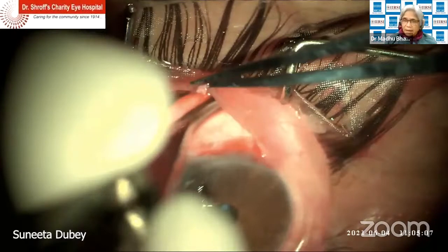Depending upon the kind of eye you have, if the eye is slightly deeper set, it tends to go behind. So all of that has to be brought out, whatever has been used, because mitomycin is a toxic drug.